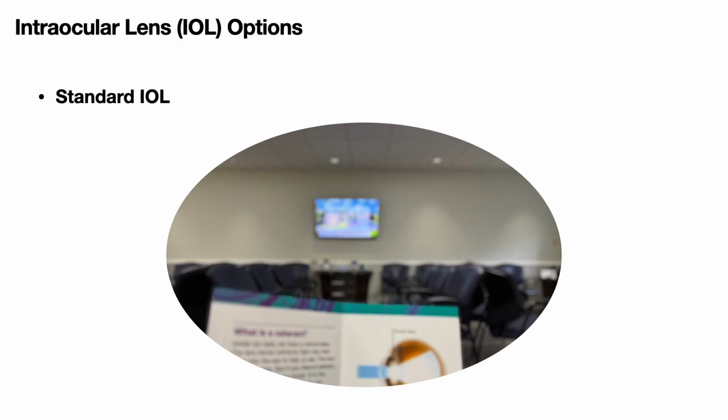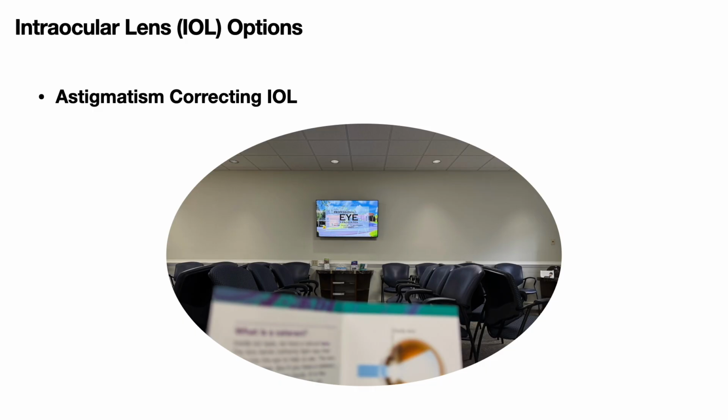With that lens, you will notice that it makes the distance TV clear. However, please note that up-close vision will still be blurry and often require reading glasses. Similarly, sometimes people may use this lens to make the up-close vision clear, but then they still need glasses for distance as well.